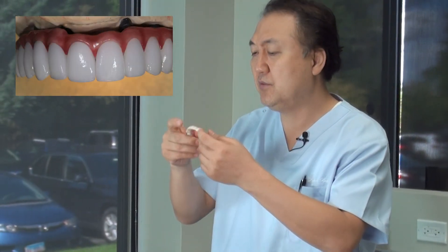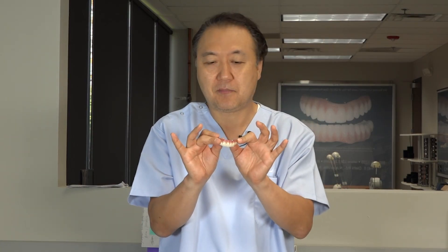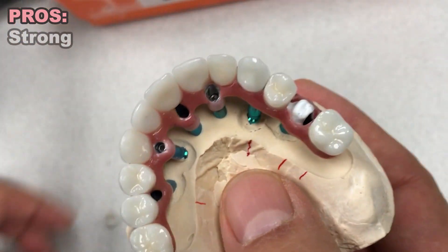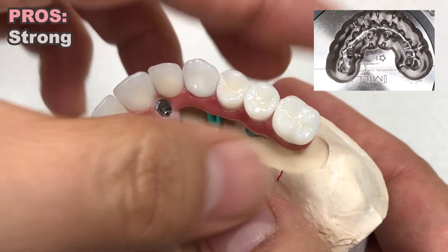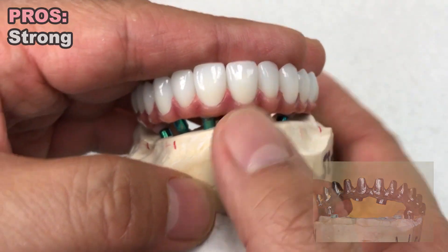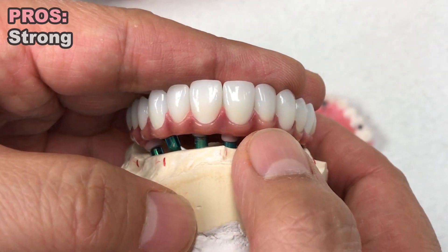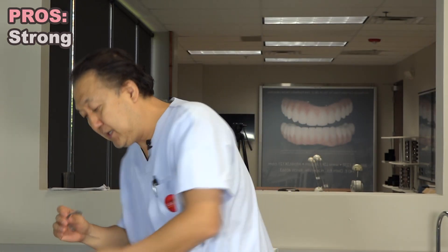Zirconia is top of the line and very expensive because there's a lot of work, labor, and high-end skill involved — each step has to be thoroughly done. The pros: this is all ceramic. Underneath it has a hybrid wall — we make a special thin design underneath so I can control the top, so it won't break. This is almost like titanium.